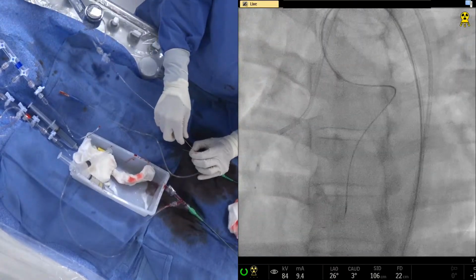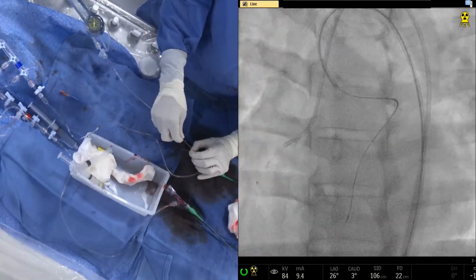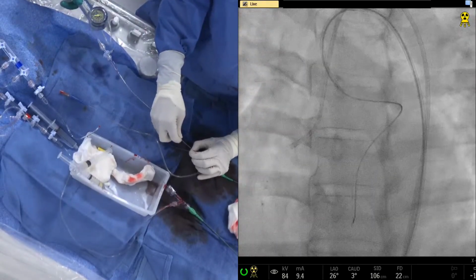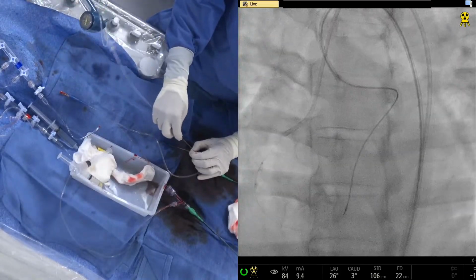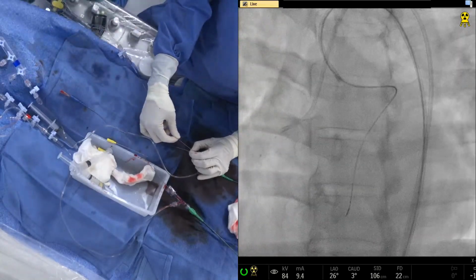You probably need to go a little bit more. We are doing a little different. Okay, down. And a little distal. Yeah, here, good. We can take a little bit of picture and see. There's the dilate proximal here, lesion also.